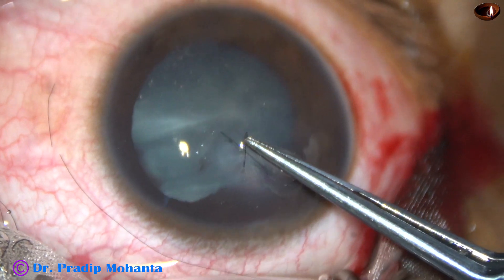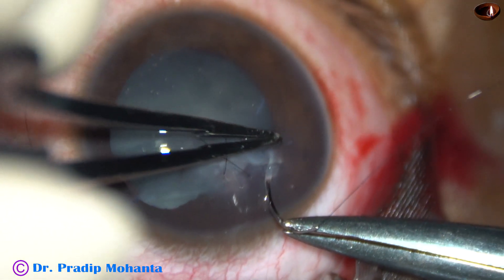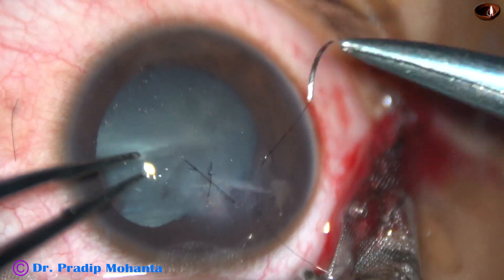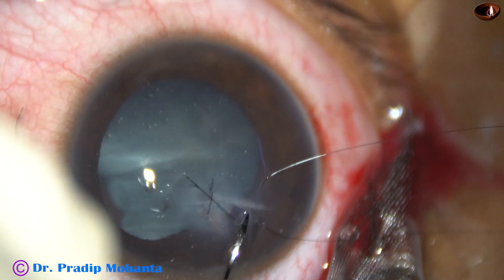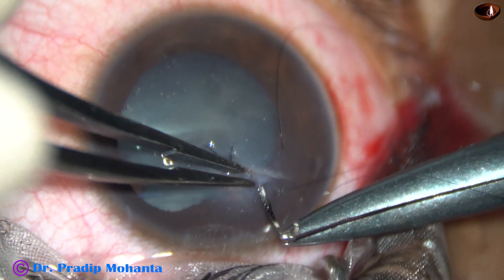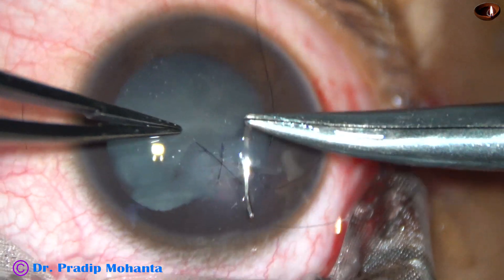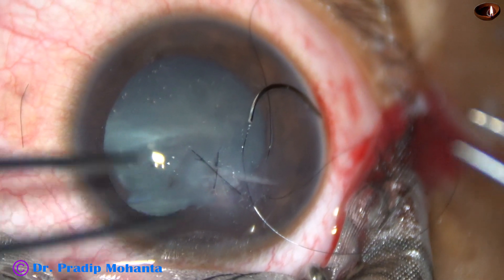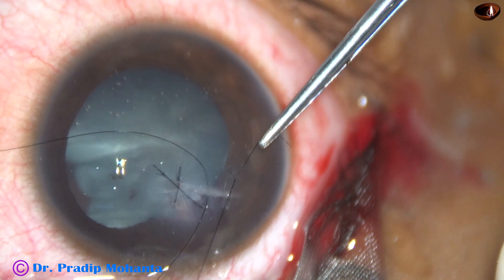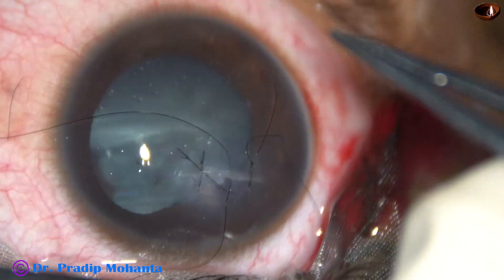In this case, as I tried to bury the knot, sometimes we cannot bury it in one direction — then we have to come from the other direction. Here I am placing 2 bites at one go. After putting these 2 bites, the threads are pulled. Same principle: two throws, then one throw, and then one more throw — a 2-1-1 knot.